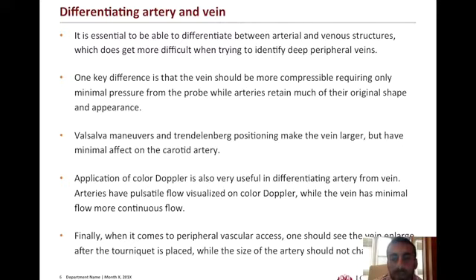When you use color Doppler, it is very important to realize that you cannot use the color of the color Doppler to designate artery versus vein, but you can use it to look for pulsatility. A more pulsatile flow pattern can suggest an arterial vascular structure versus venous.